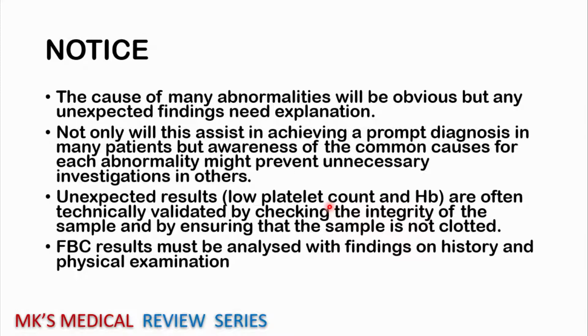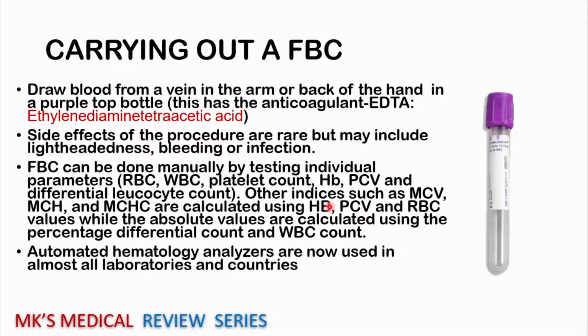So you could draw another sample to confirm, and you obviously are going to be marrying your FBC results to your clinical findings. Remember, we deal with patients. We do not deal with results. You don't treat the results, you treat the patient.